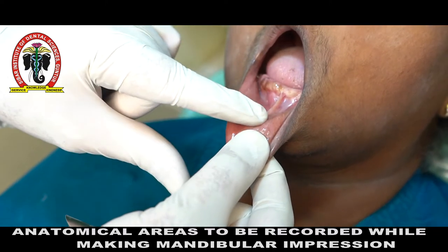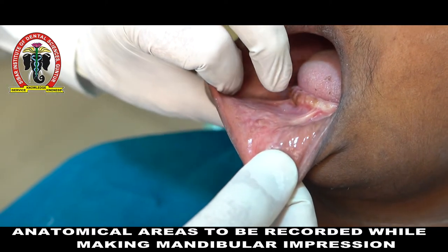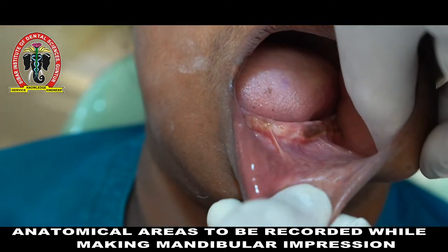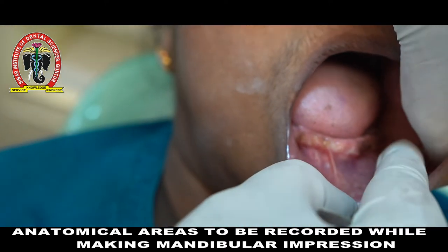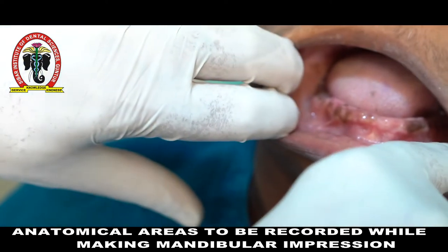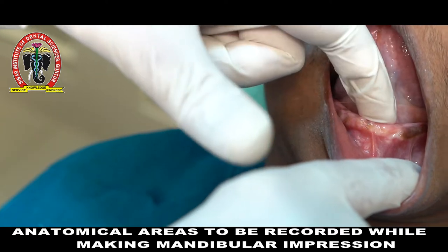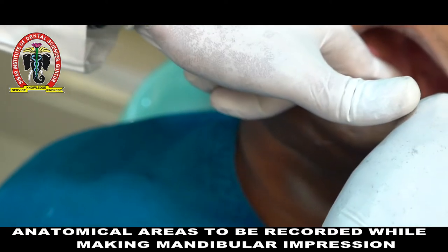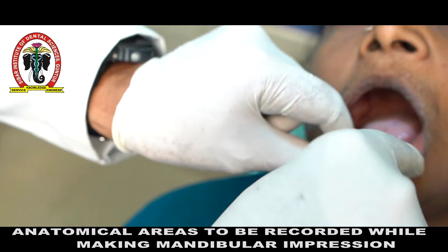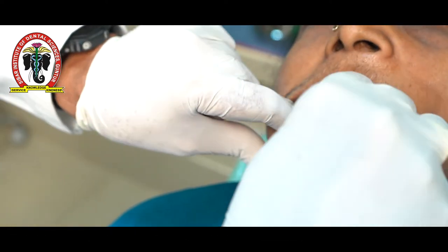For the mandibular arch, identify the labial frenum, the buccal frenum area, the other side buccal frenum, the lingual frenum region, the retromolar pad. The tray should cover all of these required anatomical areas with adequate space for the impression material.